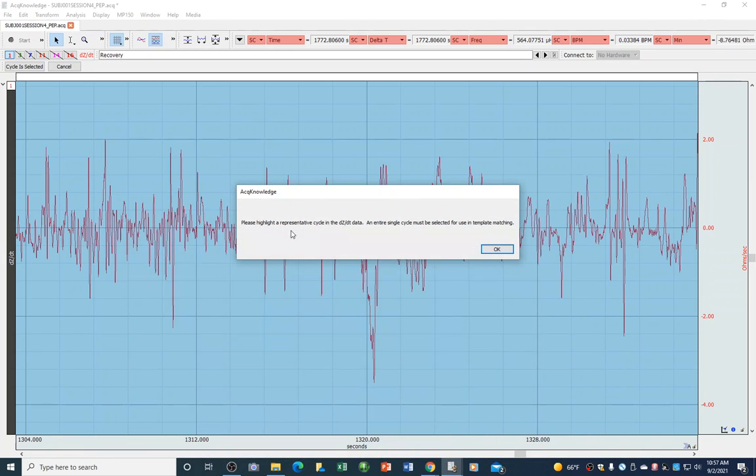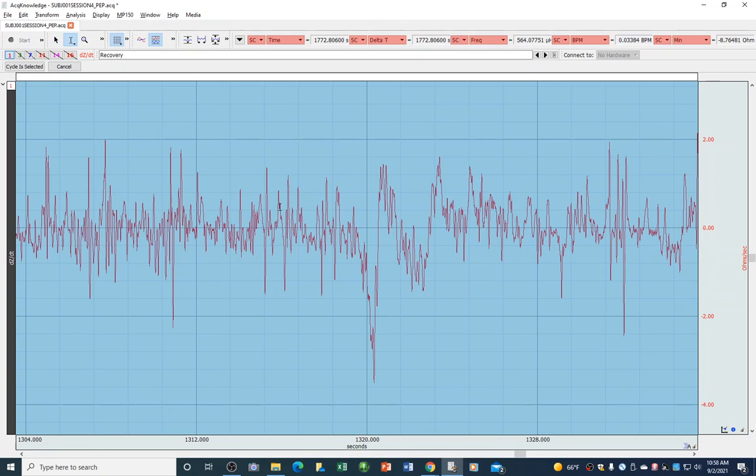Okay, so now we need to highlight a representative cycle in the DZDT data. So we can get access to our data again. First thing to note is these files generally leave off in a very small window of data. We're at 1304 seconds to 1334. So we have about 30 seconds of data in what might be either a 30-minute or a 90-minute data set.